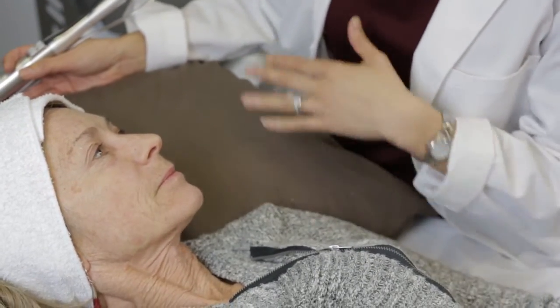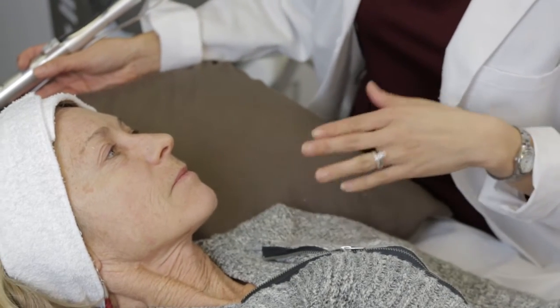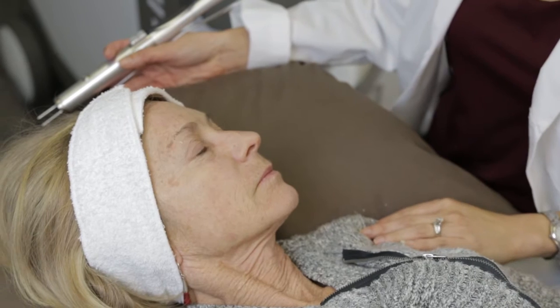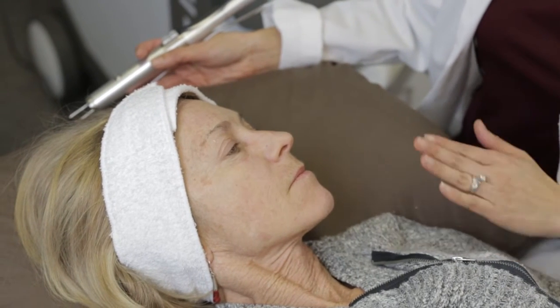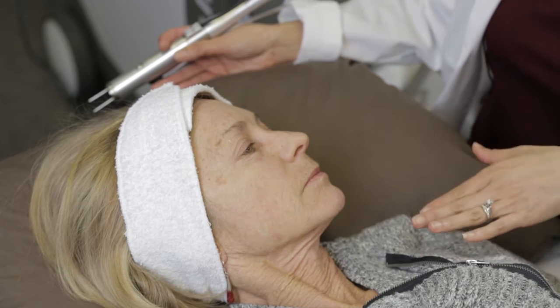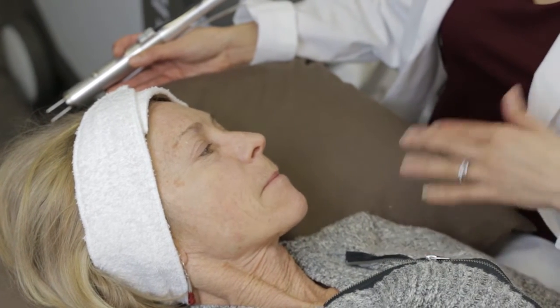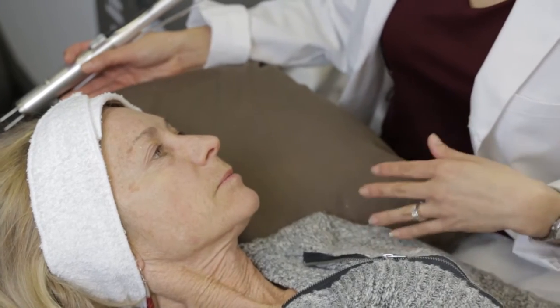Before we get started, make sure that the skin is clean. I usually have my patients cleanse their face first and wash their whole face with a mild soap, then I also wipe off the skin of any residual oils and residue with an alcohol wipe, and then be sure that the skin is totally dry before we start the laser treatment.